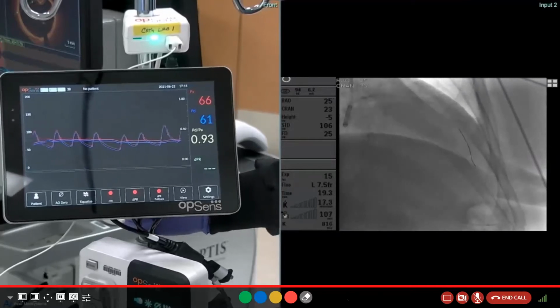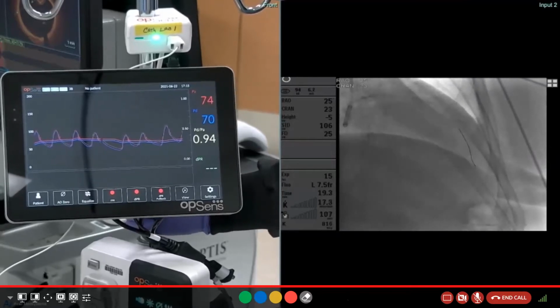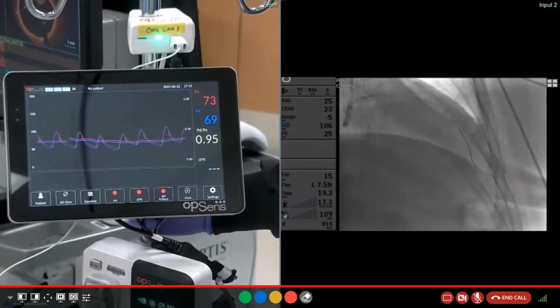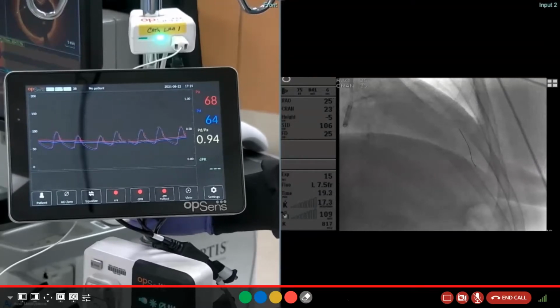What I describe is you have to kind of feel with your eyes. You get used to seeing, as you see the tip start to move, it's the equivalent of tactile feedback. The wire, you've got to get used to it. You and I both do similar movements in that we're subtly moving with our hands as we go, keeping it off the walls. So you kind of go left, right, left, right, left, right. It's a fairly quick learning curve, in all honesty.